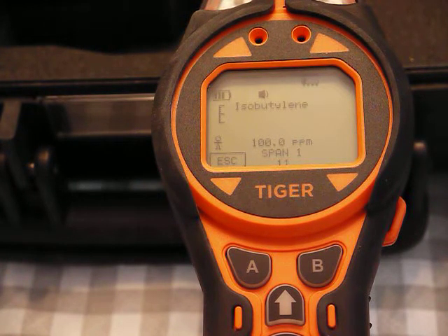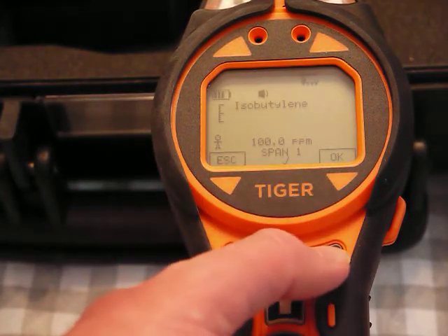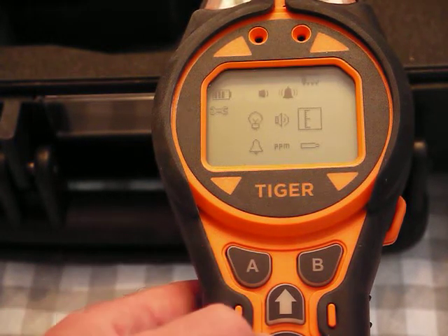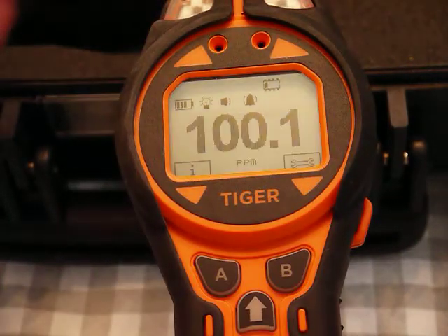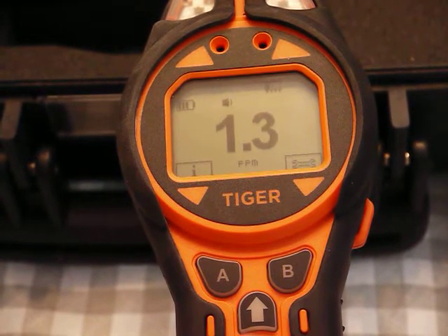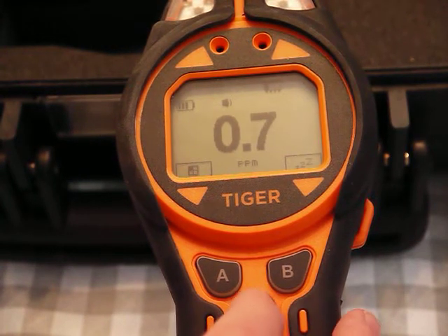The first alarm is at 50 and the second alarm is at 100, so we may hear it go into alarm. It's done — calibrated, shows the little check mark. I hit okay and escape out. I can see it's giving me 100. I take the gas off and see how quickly it goes back down to zero.